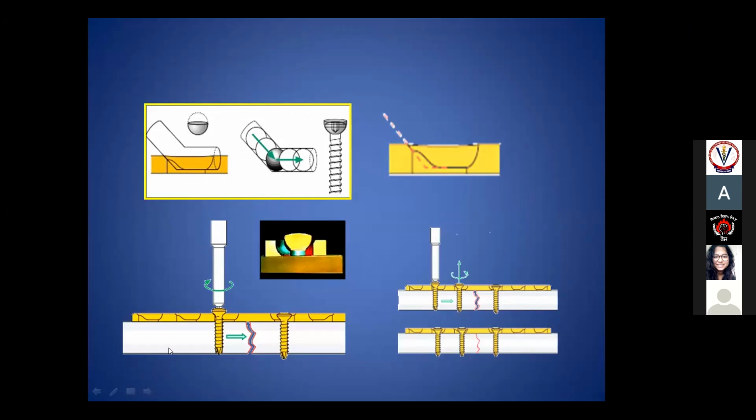Here is how it slides. Now see, this is the fracture line. The first hole you have drilled with a loaded guide has created movement. Now the second screw you are tightening causes compression. Ultimately, when you apply three screws, this fracture gap you see here has been completely reduced, and you have created compression at the fracture site. Because by application of the plate itself you are creating compression at the fracture site, this is called dynamic compression.